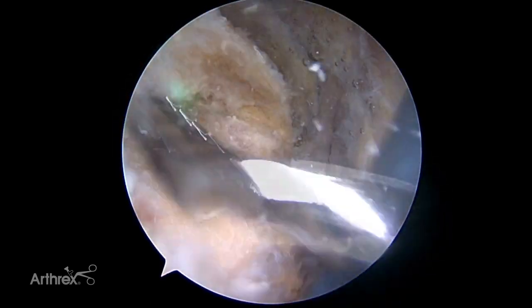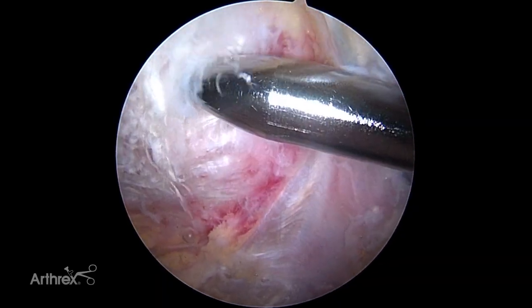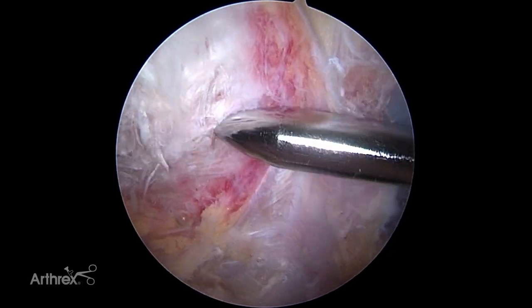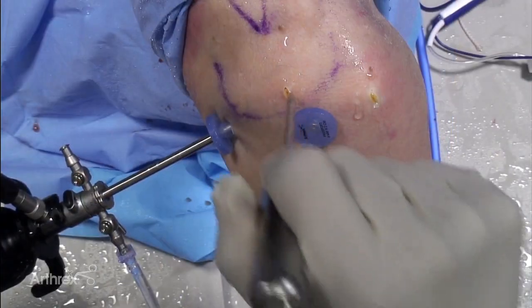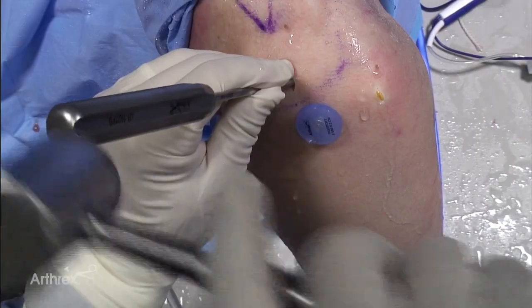The rotator cuff footprint is prepared using the power rasp and torpedo shaver. The anterior medial bone socket is prepared at the articular margin.